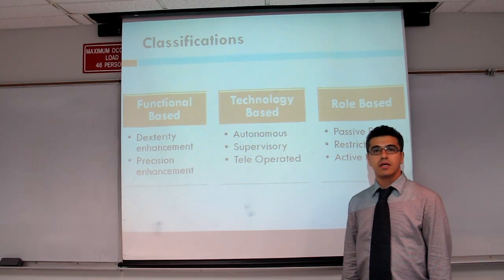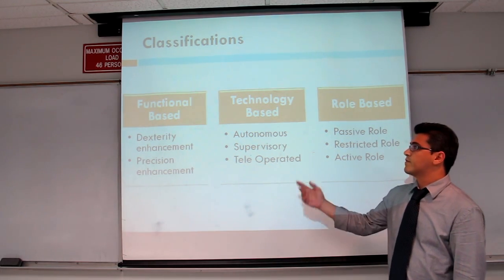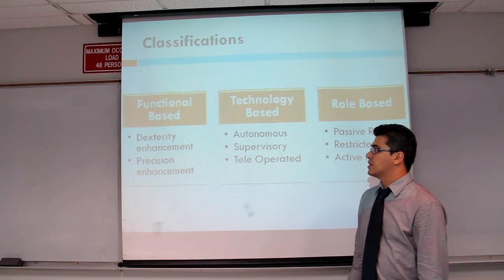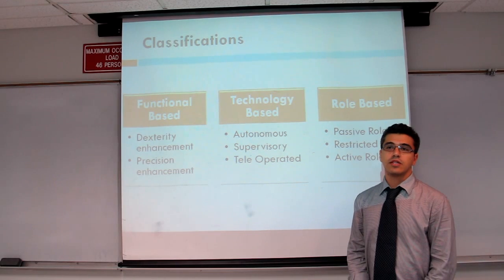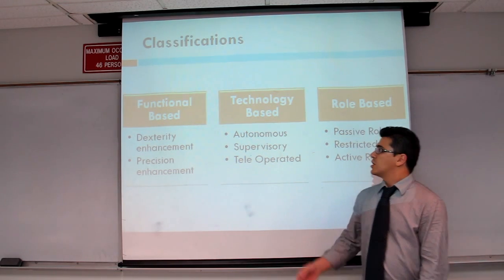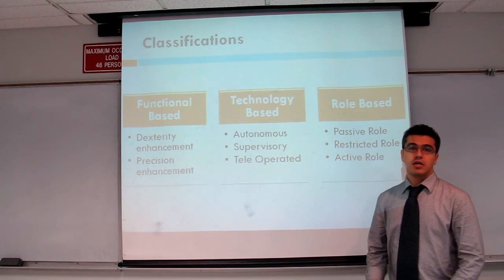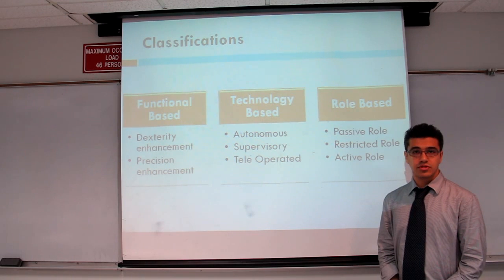Surgical robots can be classified in three different ways. First, we can classify them based on the functional base, where they can lead to enhancement of the dexterity and precision of surgery.